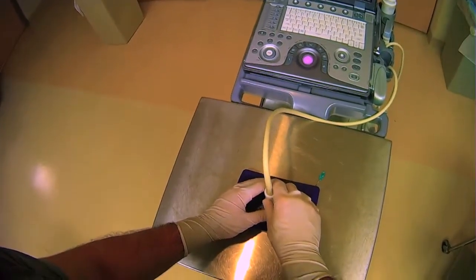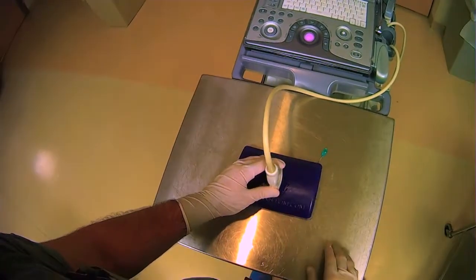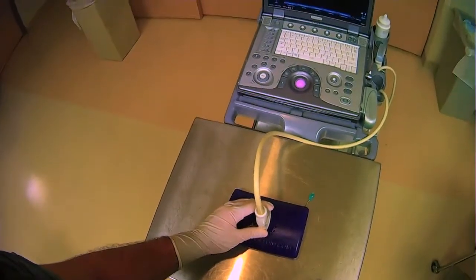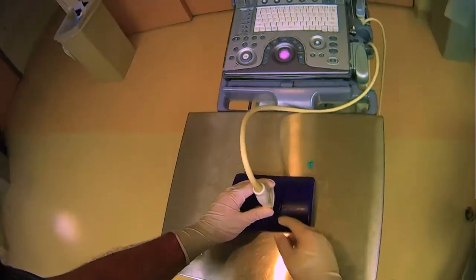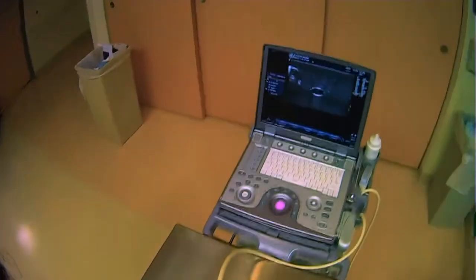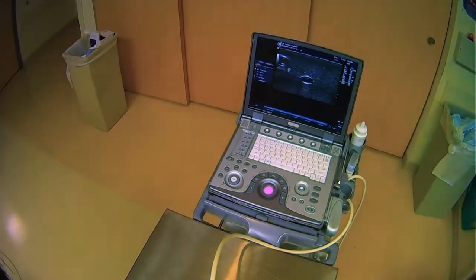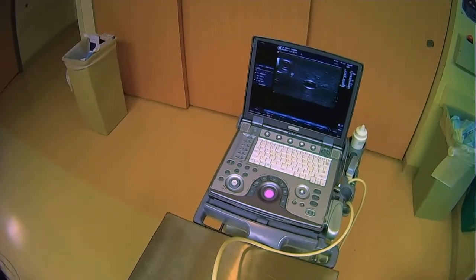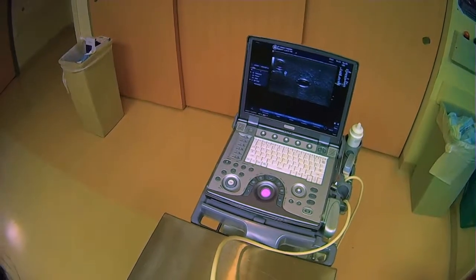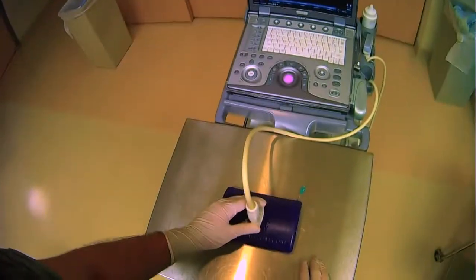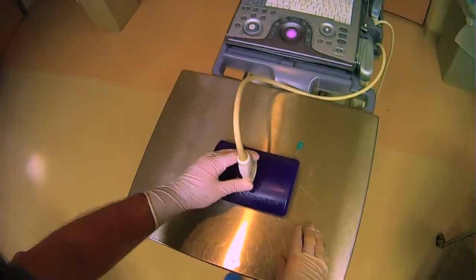Now I showed you fairly quickly how to insert your needle when the probe is faced in this direction and you see your vessel there in its cross section, but we're going to discuss a little bit more of the finer details.